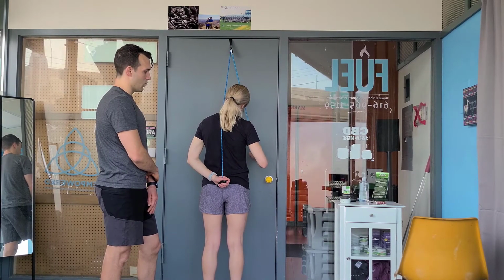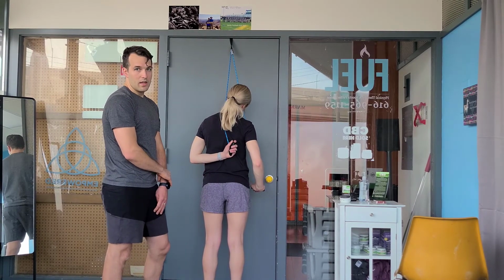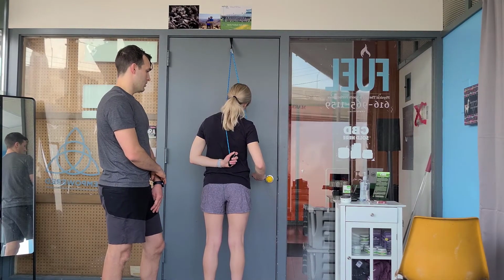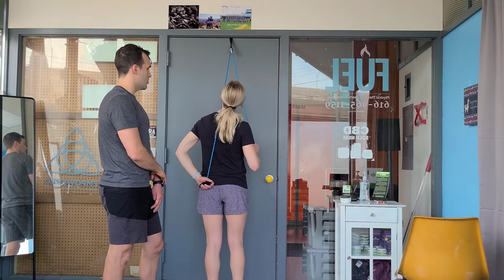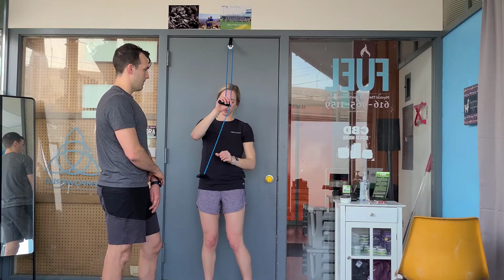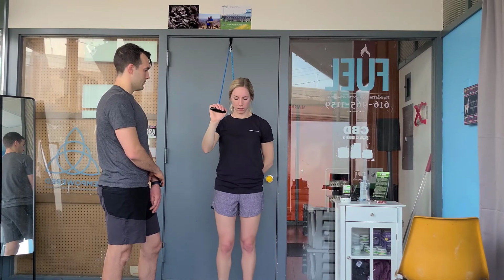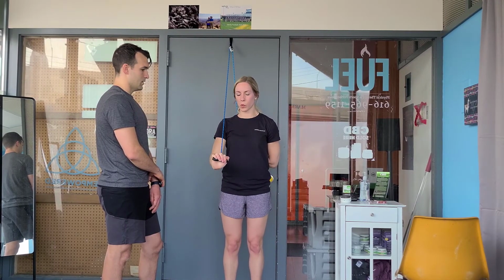And just like that, you can work on really getting able to reach behind the back, hook and unhook a bra. This is great if you're a female. And go ahead and show them the other way just so they can see how your arm is. Turn around this way. Yep. So again, you may need help, but the right arm is doing all the work. Yep, just like that. Excellent.